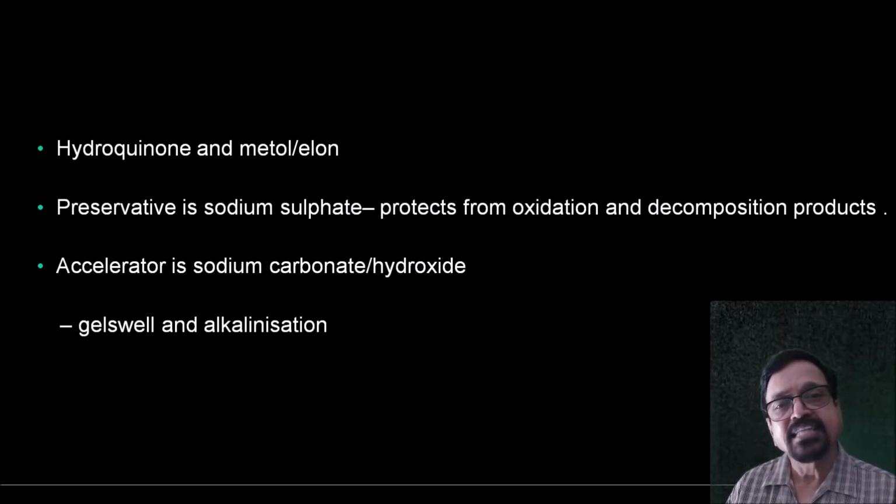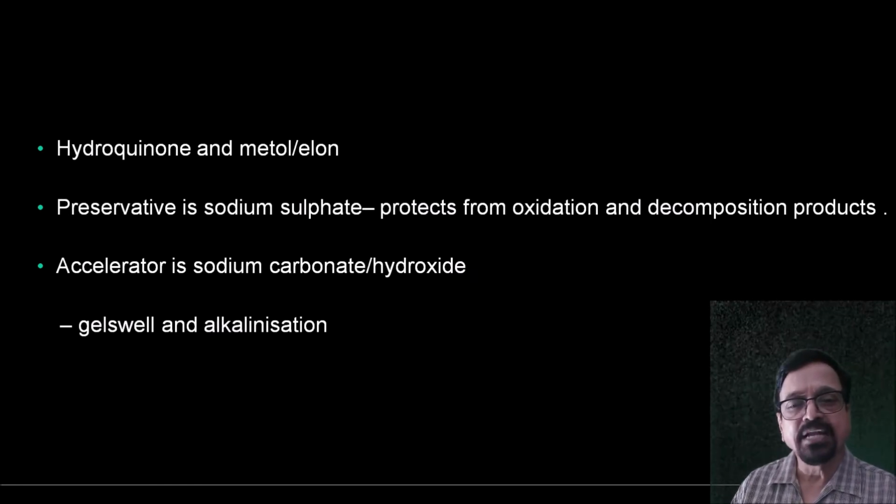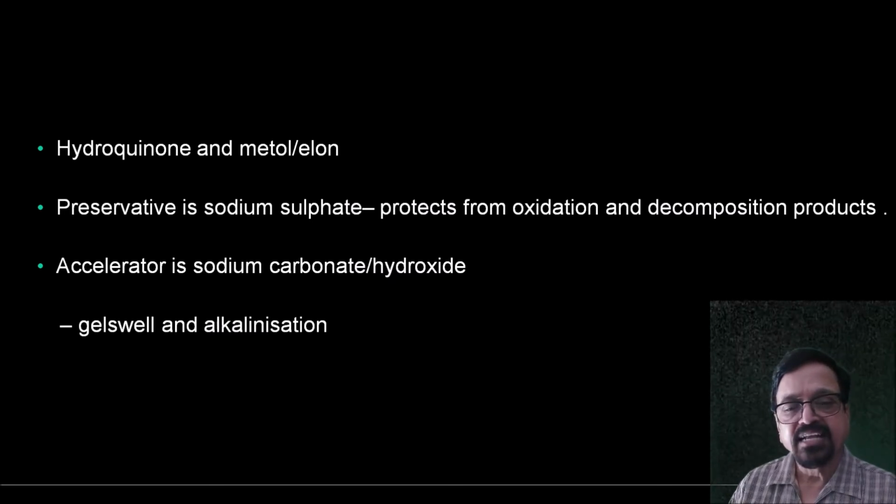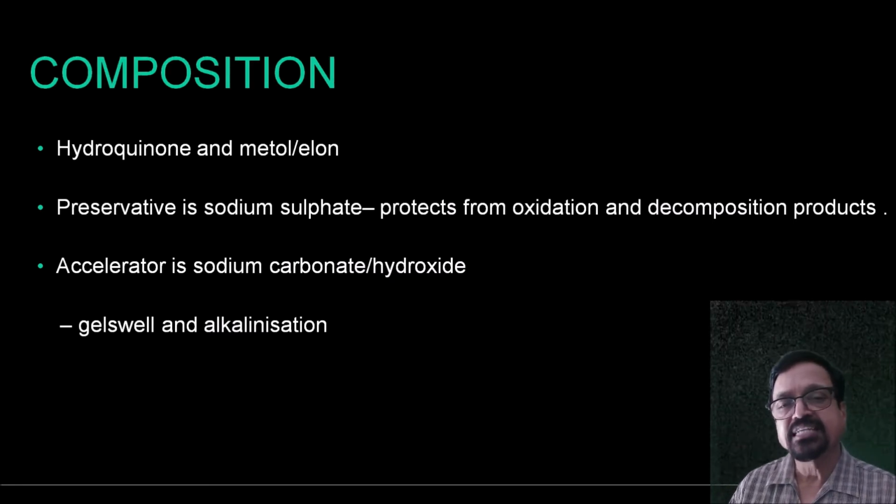Then there are some accelerators which will enhance the speed of development. That is sodium carbonate, hydroxides, and gel swell and alkalinization. So these are the things which will accelerate the process, and these are the compositions of the developer.